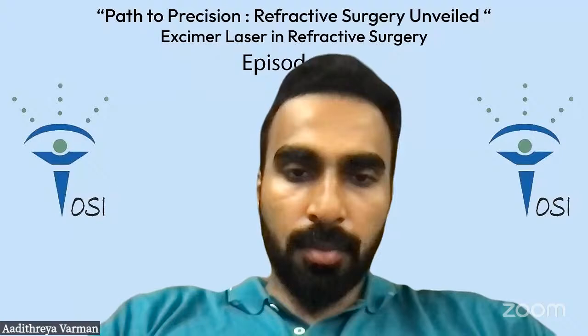So, let's agree that gone are the days when patients would accept anything. Why do you think there was a buzz of Contoura or a buzz of Wavelight Plus? It's because patients want 20/20 or 20/10 on day one. And when you're dissecting in SMILE, you don't know why it's not 20/happy on day one. That's when the popularity of CLEX procedures reduces. So I think one of the factors is biomechanics, and of course the learning curve, where it helps to predict whether your patient is going to be 20/happy on day one or not.